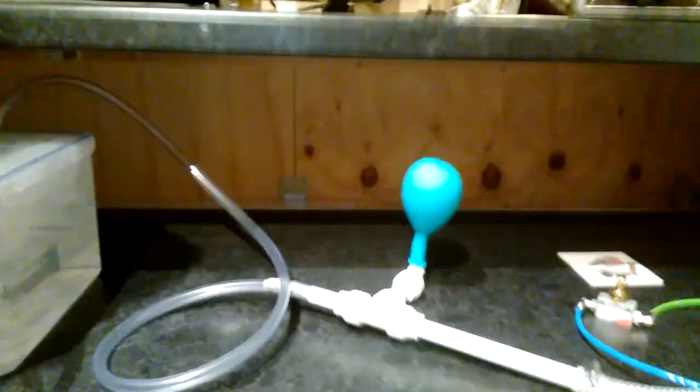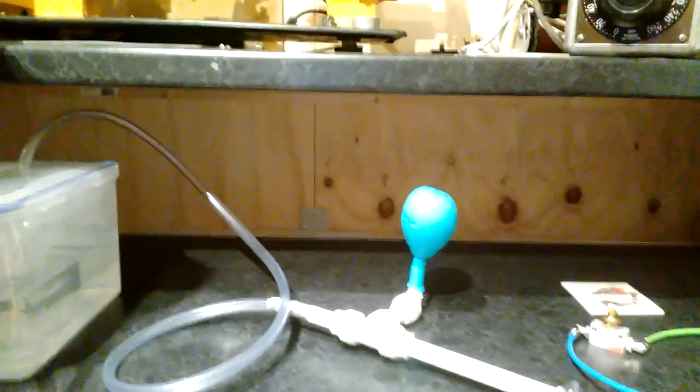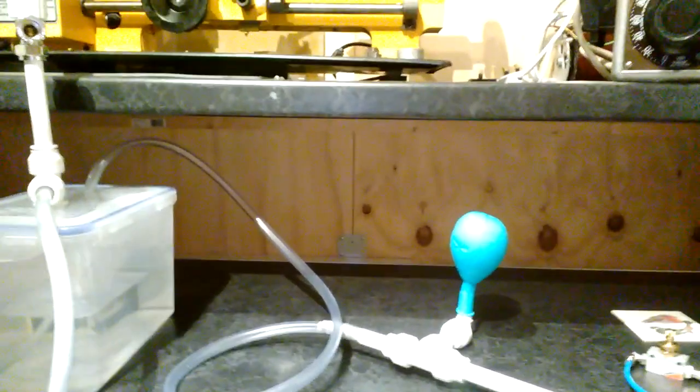Turn that off now. Now, the thing about this system, because it uses a balloon, it's using the balloon essentially as a pressure regulator, as a safety valve to ensure that the pressure of the air going into your lungs is never more than the pressure that a balloon can take. Now, if you think about it, you can blow into a balloon until it's so full that it bursts. So that means that the balloon bursts before your lungs do. And that happens at around 60 centimeters of water, which is roughly the same as 60 millibar.